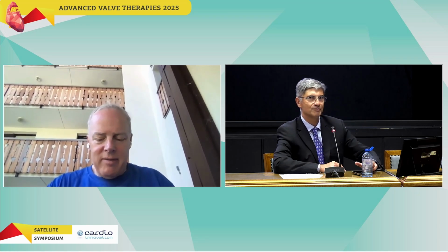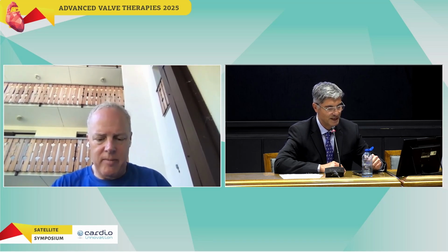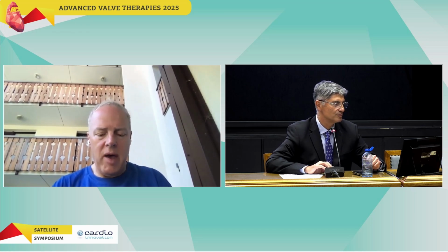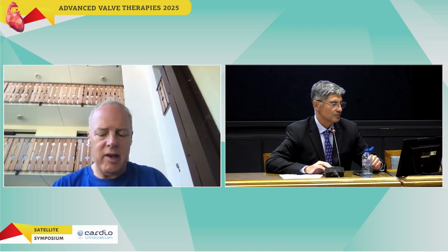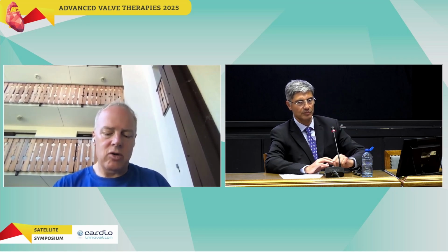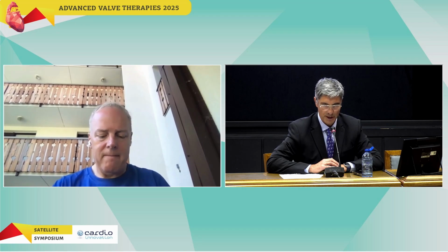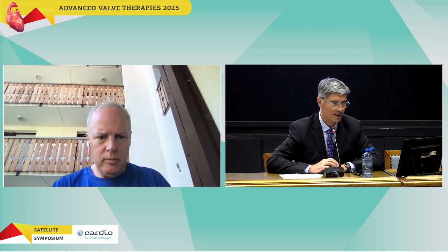Well, you know, I issue a health warning about cross-study comparisons. I showed you that slide, looking at the patients in EMPERE-1 that would have met the entry criteria for the SMART trial, and you can see that there's an incremental benefit for Allegra even over Evolut. But of course, it's open to debate whether or not this will eventually lead to earlier bioprosthetic valve failure. We just don't know at the moment. So yes, we will be open, of course, to the upcoming studies for that.